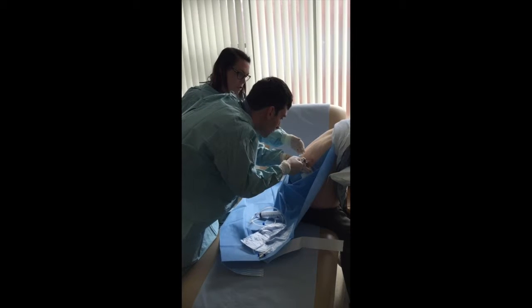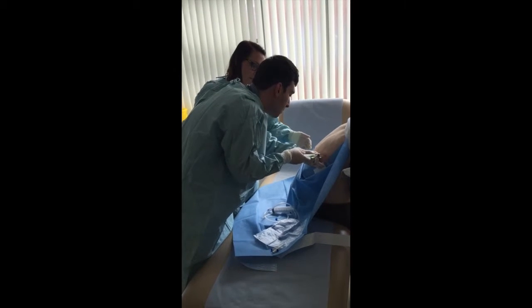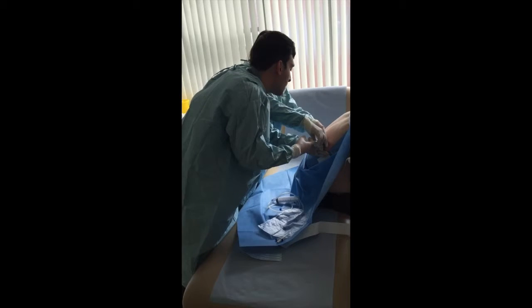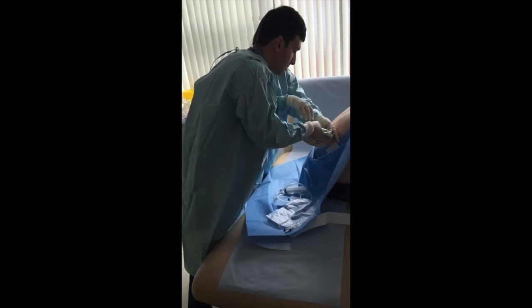There's a little bit more pressure because it's a wider bore, so just aspirate as you go through, remembering the depth and the angle that you're going to get your fluid from. Just a little bit of pressure, and actually you might find it more comfortable if you put the flat of your hand right against the wall here. You're balancing the needle on it and everything's really nice and controlled.